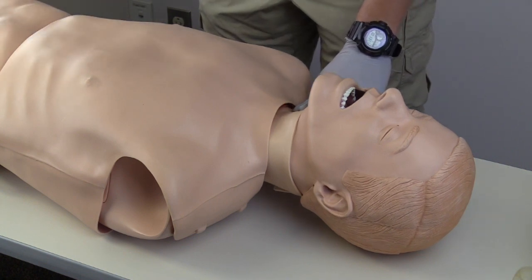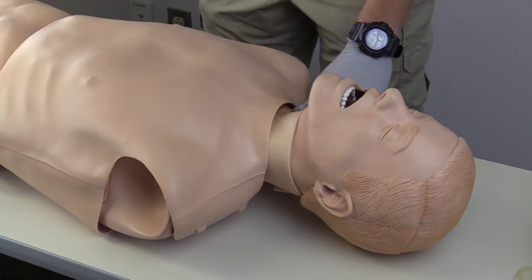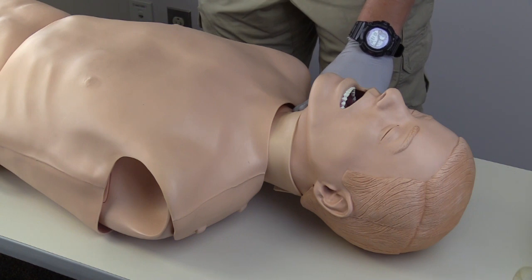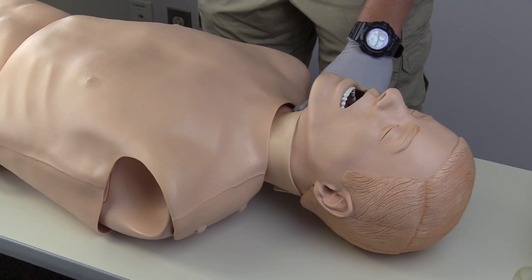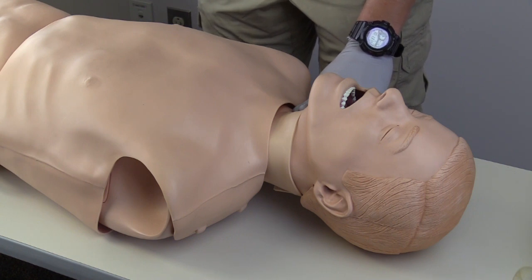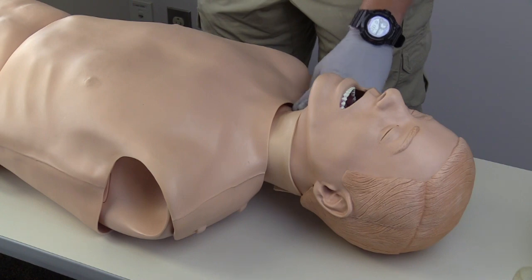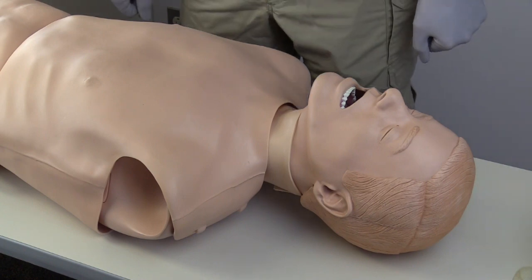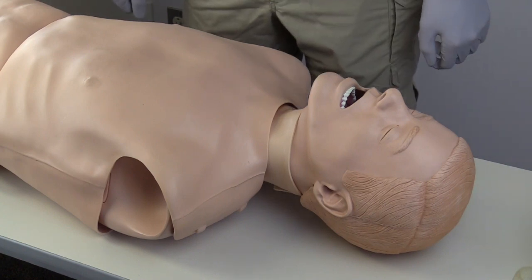Next, I will assess for a carotid pulse for at least 5 seconds, but no more than 10 seconds. Since there is an adequate pulse, I will not have to perform CPR.